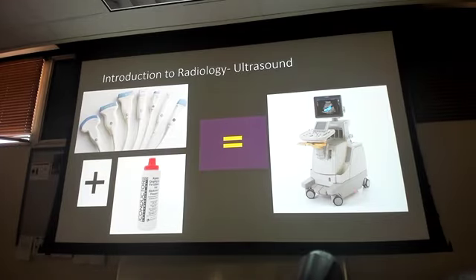Those things in the upper left are your transducers, different kinds for different parts. Don't worry about that right now. You will learn that more in your senior semester when you actually get the hands-on EFAST on each other, which is super awesome. When I came through, we didn't do that. Partially because ultrasound wasn't as widely used bedside as it is now. EFAST was still kind of growing in that aspect, and now it's used everywhere. So super cool that you guys get to do that.